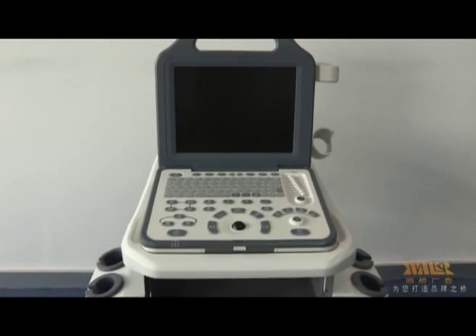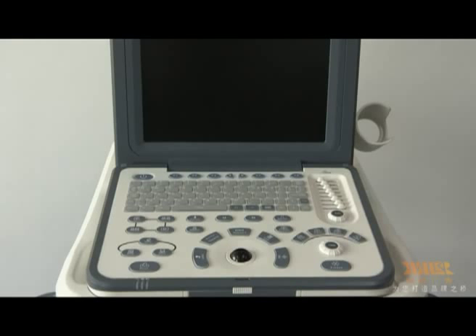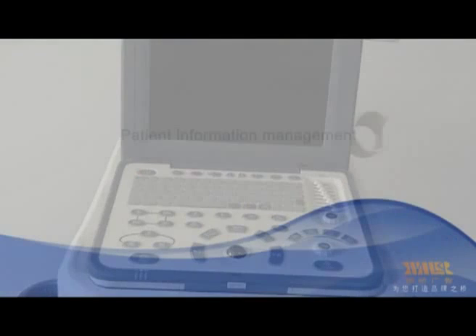The layout of the control panel is divided into several parts according to function: the shortcut keys, patient management area, save and print area, main control area, image adjustment area, and keyboard.